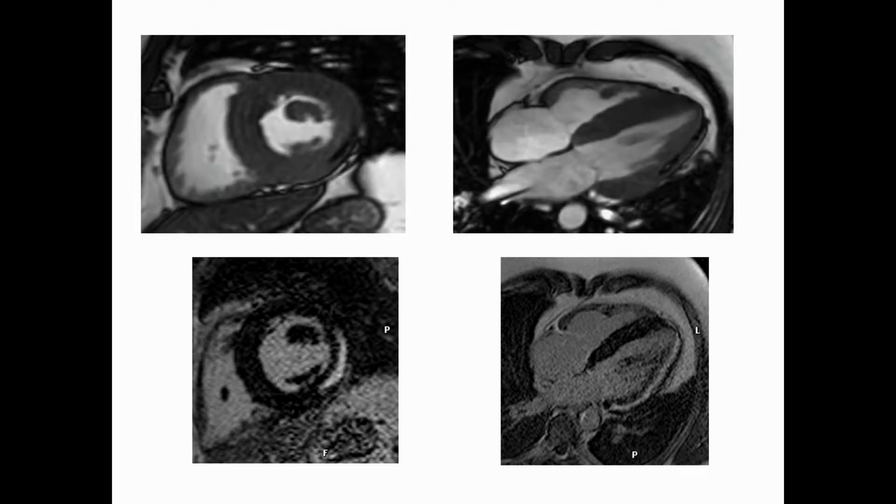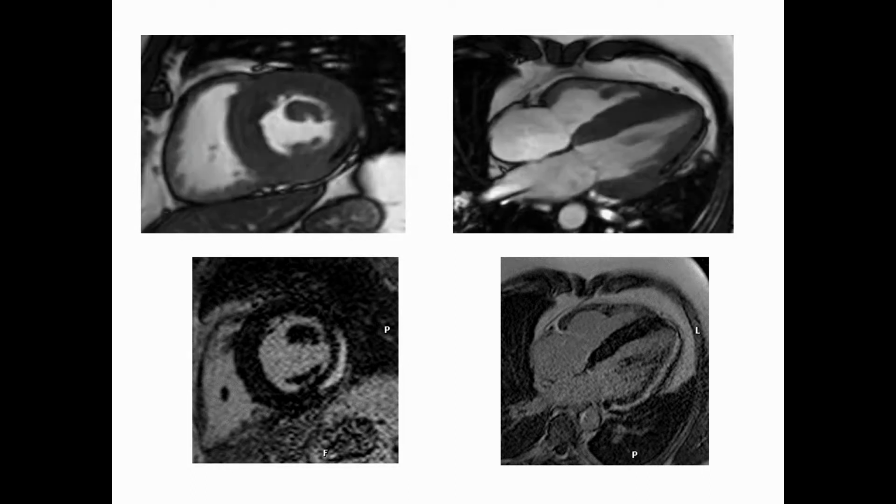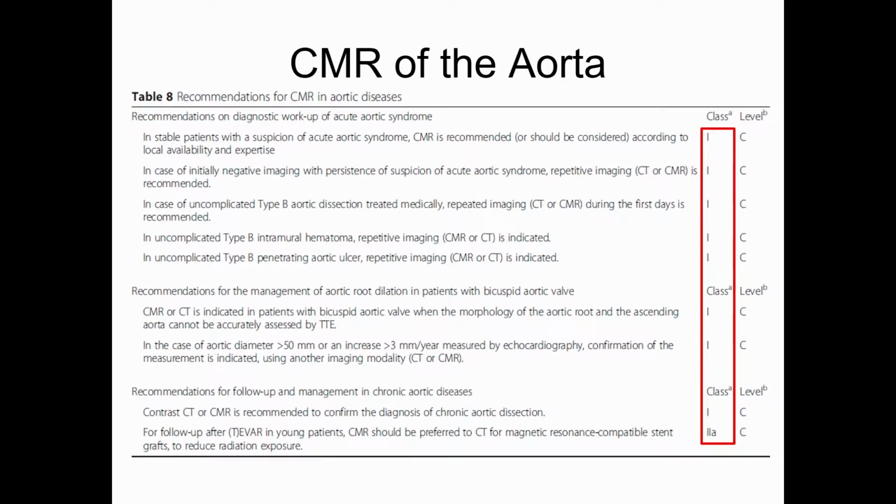It's not an infarct. Infarcts always involve the subendocardial border. You can see the subendocardial sparing. You can see straight away that this is not a missed infarct. This is acute myocarditis in a young patient who doesn't then need dual antiplatelet therapy and lifelong secondary prevention. So it's important to get the diagnosis right.